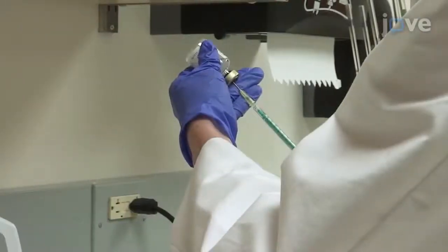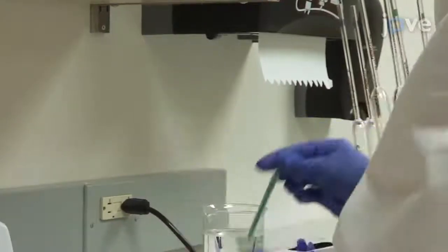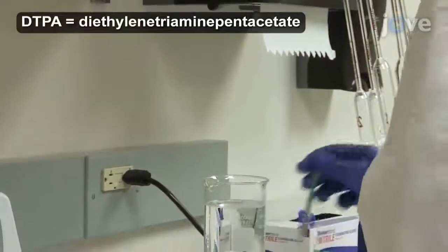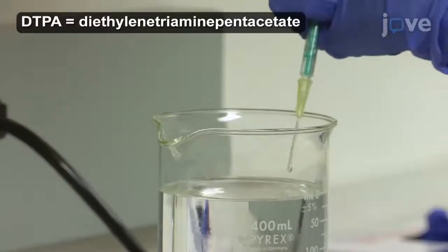Using a clean syringe, measure 0.24 milliliters of the gadolinium DTPA contrast agent. Add it to the beaker using the same technique.